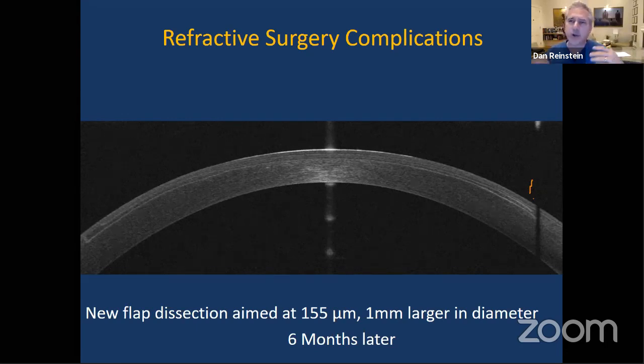I think that things like trans-PRK and PRK in this situation are the old way of approaching these problems. Because in the old days, there was no knowledge of anatomy. And so you just say, I don't know what's going on here. I'm not gonna take a risk. I'm gonna put the patient through a lot of pain and anxiety and hassle for a month, because I don't know what to do. And I think what you did here was fantastic, because you used powerful imaging and measurement technology to plan the next surgery. And that's just fantastic. Yeah, congratulations.